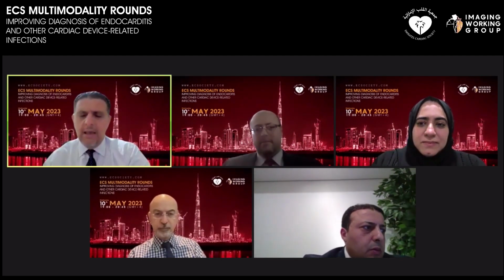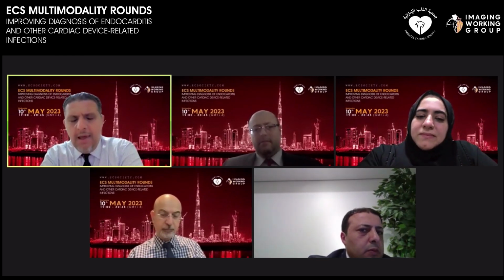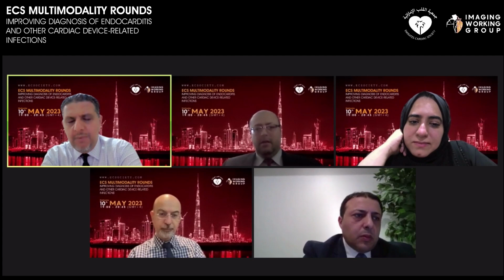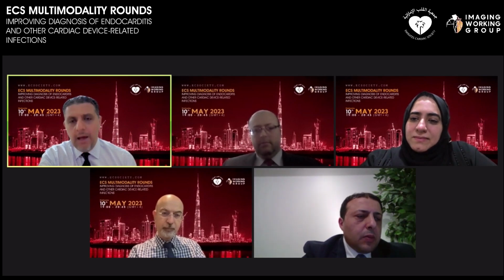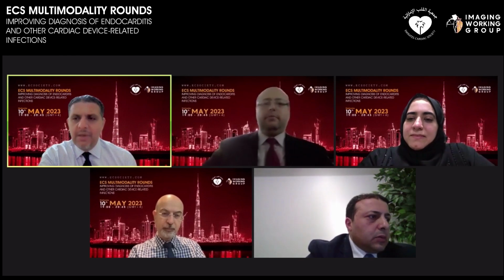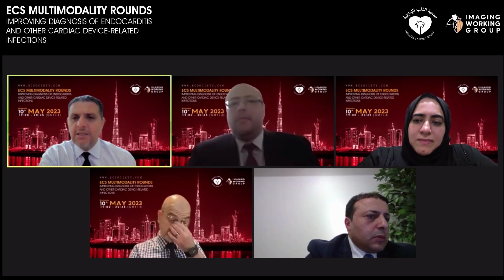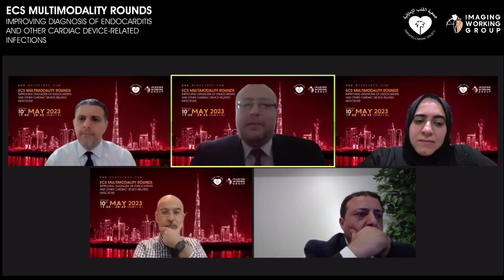You know, part of the issue, and maybe Mohammed will agree with me, is that the difficulty we encounter with utilization of PET for inflammation and infection imaging is the difficulty of getting patients to comply with the dietary restrictions and the concern about getting a non-diagnostic study. In a busy lab like yours, Muad, how often do you run into equivocal or non-diagnostic studies because of poor prep alone?